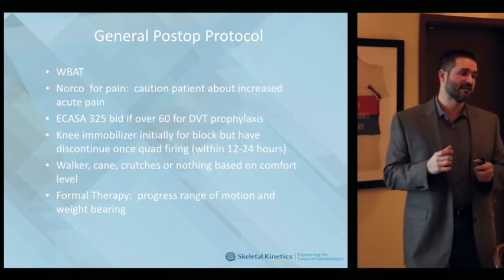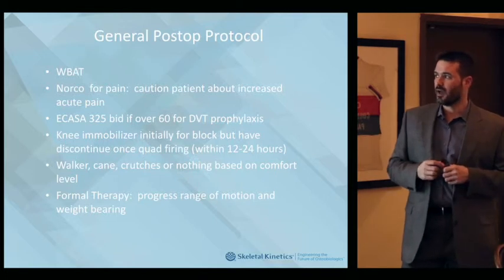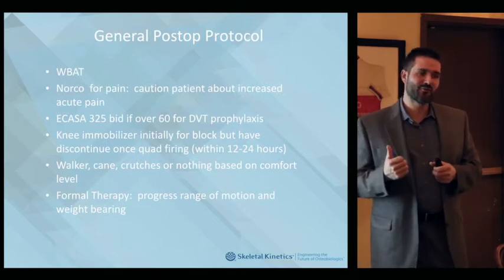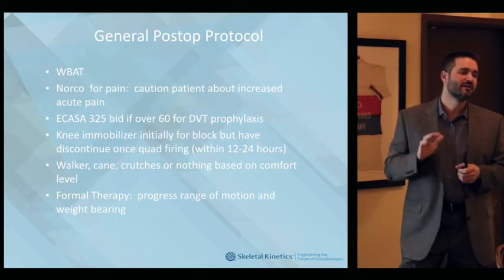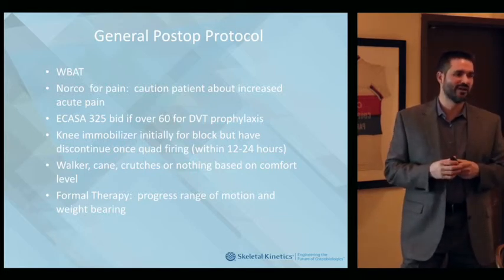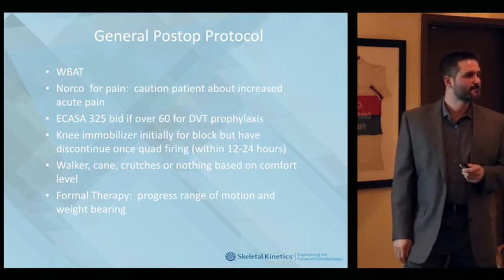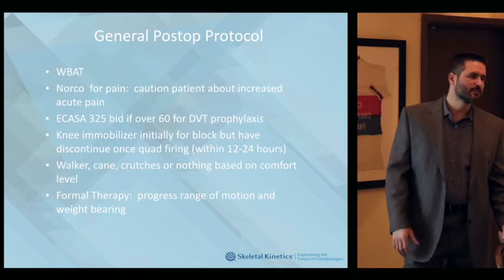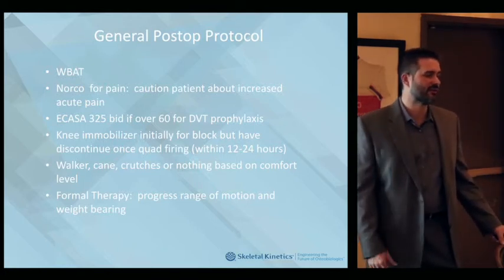The one thing I will tell you, and healthier bone, like your runners, they have better bone. The stuff doesn't disperse, so when you inject it, it's under pressure. So for a couple days, they may have increased pain. You may get a call at night and say, it's worse, doc. Just tell them to write it out for 24, 48 hours, that goes away. And I've had 1 or 2 like that. Is it then that maybe we should just not inject so much substance? Possibly, but after those 24 hours, 48 hours, they're fine. They just say, it hurts more, doc.